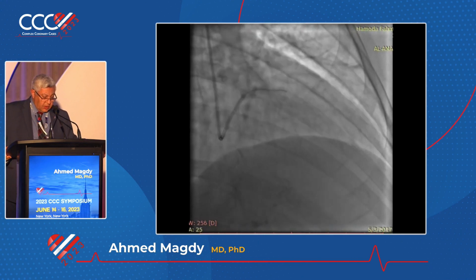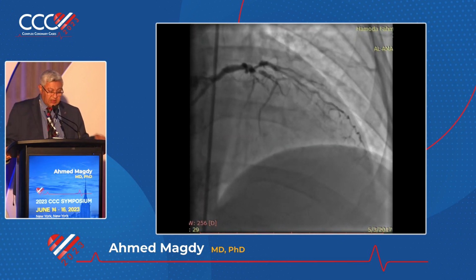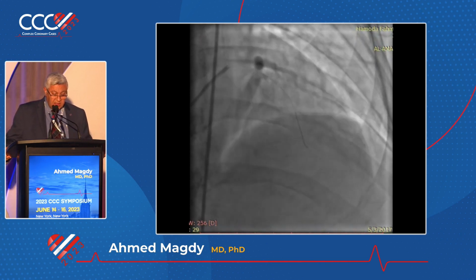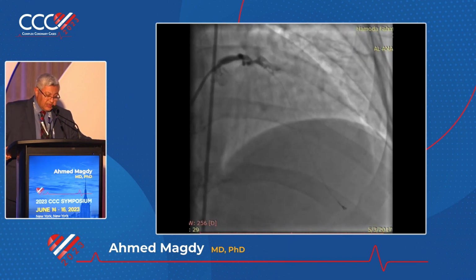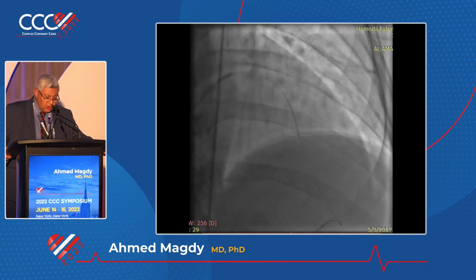And since we have DCB, you can think of stenting the proximal parts after lesion preparation and then just doing balloon DCB for the distal parts. If they are still stenotic, because after improving the proximal, sometimes what looks like very bad distal runoff improves. So this is after the balloons.